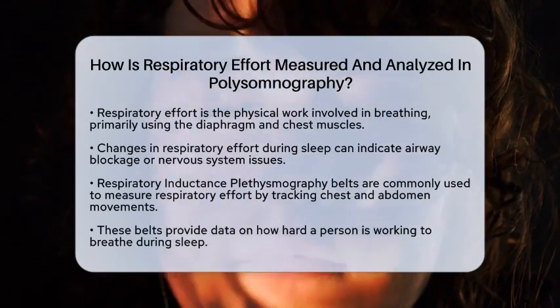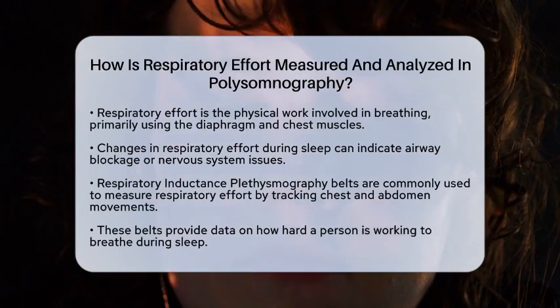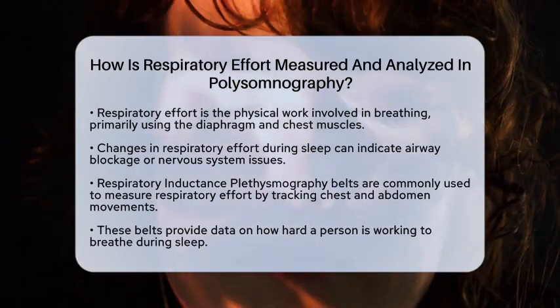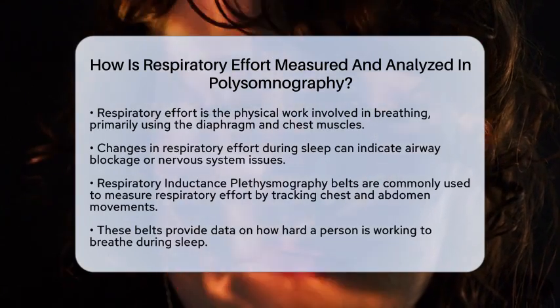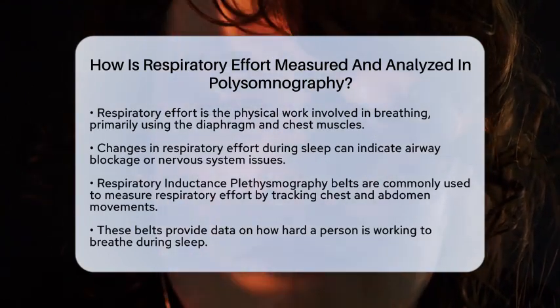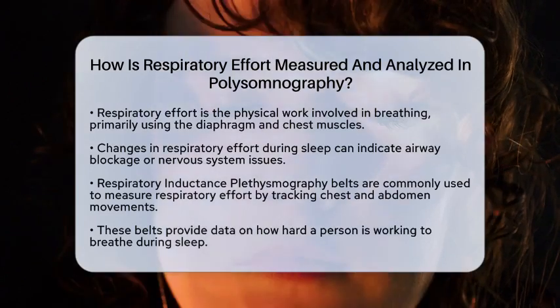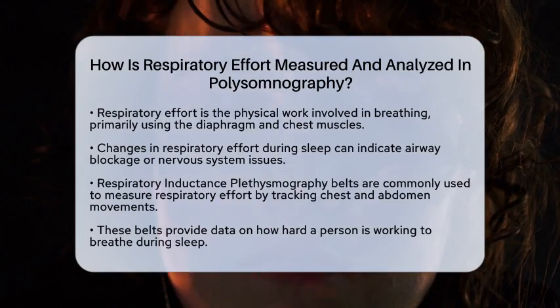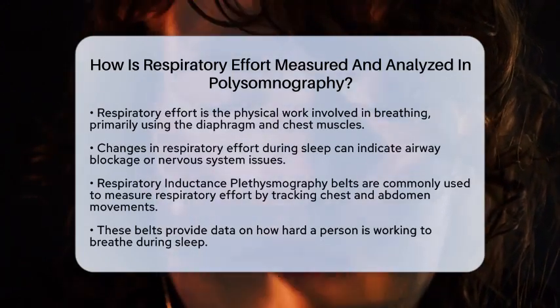Respiratory effort is the physical work your body does to breathe. It mainly involves your diaphragm and chest muscles. During sleep, any changes in this effort can signal issues like airway blockage or problems with your nervous system affecting breathing. One common method to measure respiratory effort is through respiratory inductance plethysmography belts.